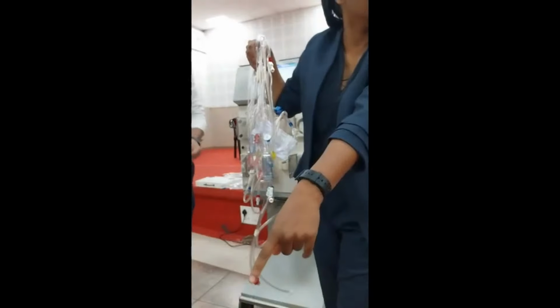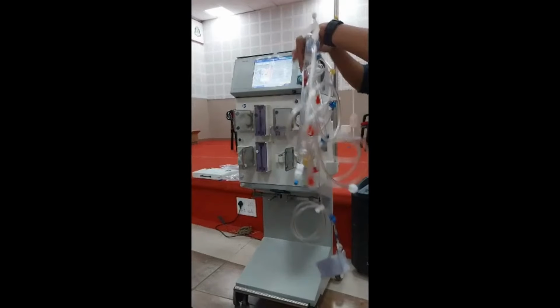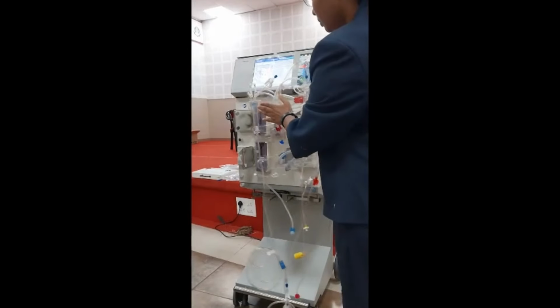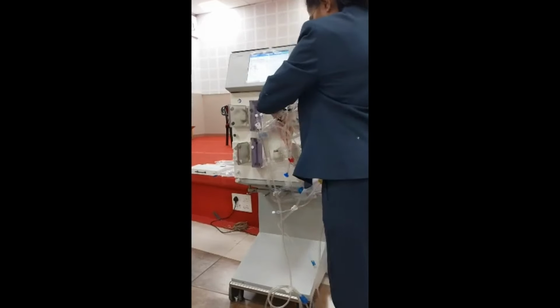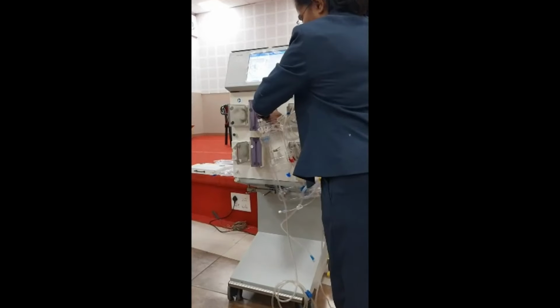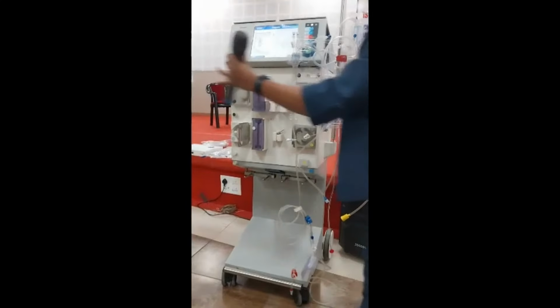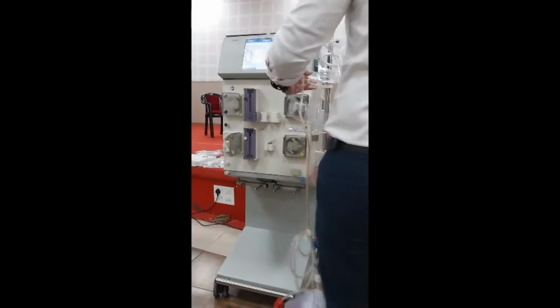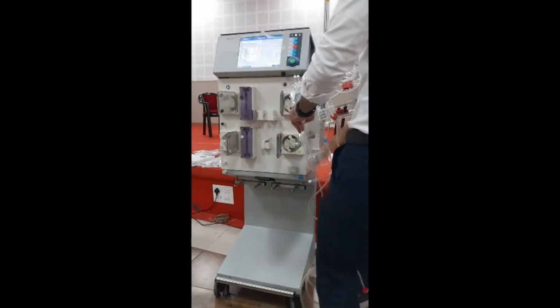Remove the kit from the bag. A pre-assembled kit is easy to use because it can just easily be attached. In the Fresenius Multipro machine, it has to be just hung on the machine and the components will fall in place. First we attach the arterial and the venous ends, and then we attach the effluent lines, the drain lines, and the dialysate lines.